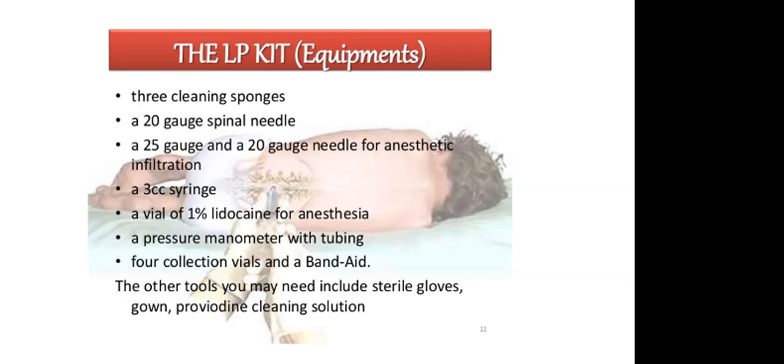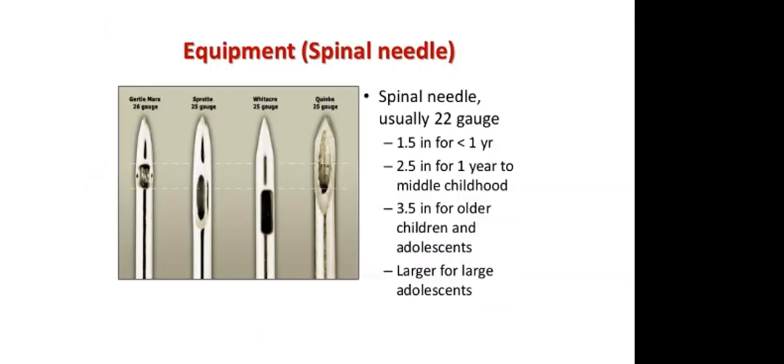Next. So I think I provide the video. Okay, this is the equipment. So the size depends on the age of the patient. So 1.5 for infant, and then larger in the older children. So it depends on the age. So I provide you the video. So let's see the video first.